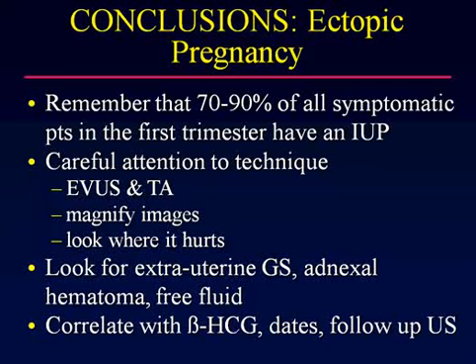And in all cases, you need to correlate your ultrasound findings with the serum beta-HCG level, the date of the last menstrual period, and in many cases, you may need to do a follow-up ultrasound examination or beta-HCG level in order to confirm your diagnosis.